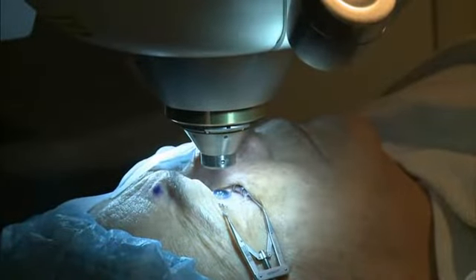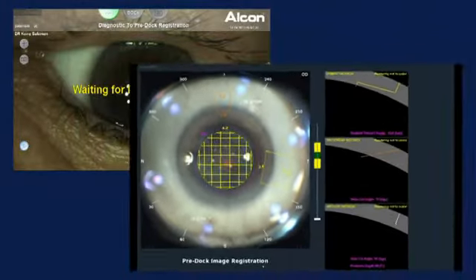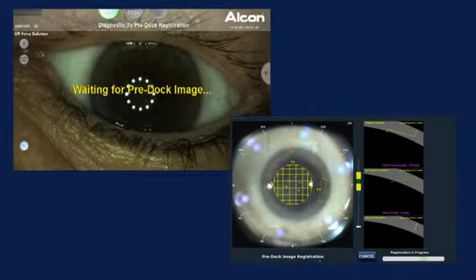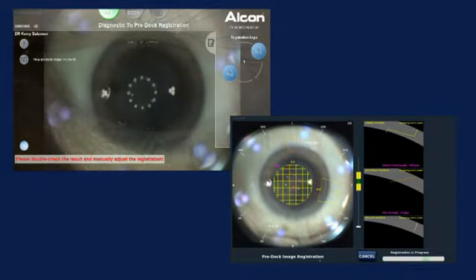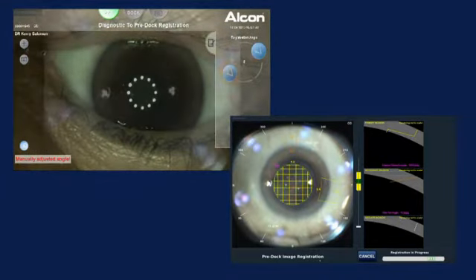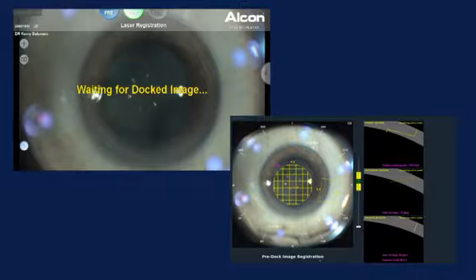You're going to look right at a red flashing light, stay right there — we're just lining everything up. We're registering the eye in the dilated form from the image in the pre-dilated form using scleral vessel and iris registration.